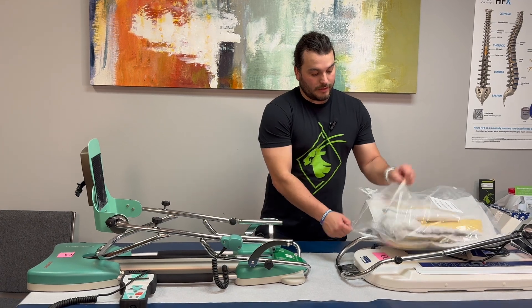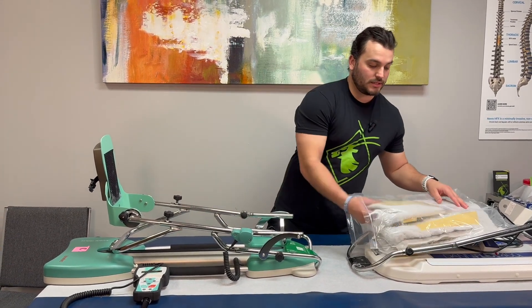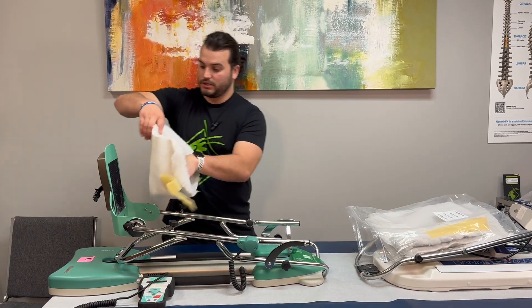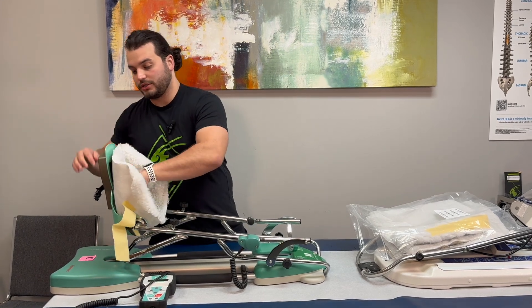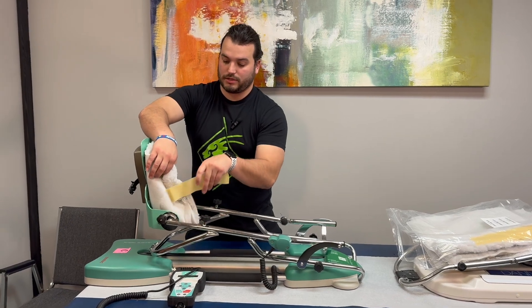Today I'm going to show you how to apply the pads to the CPM machine. These are sheepskin pads, sheep wool pads. Usually you will have this fitted to you prior to your surgery, but just in case you are not able to get that, I'll show you how to do it.